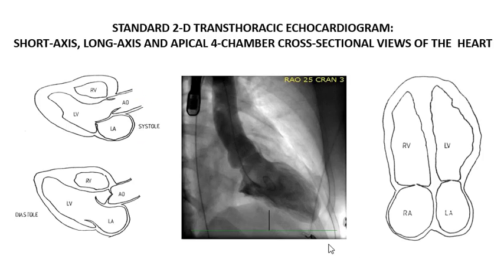Here you can see some similarities. That's the only way we can see the ventricle, except in 2 different views, as you've seen, whereas here you can see different cross-sections of your echo images. But you can relate the structure, except that here this is only the left ventricle, whereas here you can see all the other chambers. And yes, of course, you will memorize all these labels and views and angulations in your echo life, and you will immediately recognize them, as you would in the cath lab.